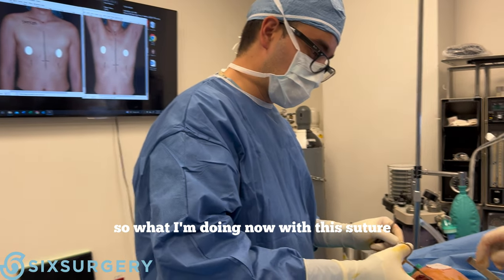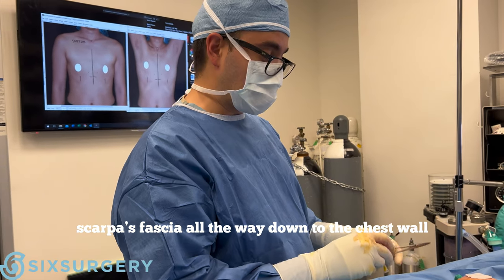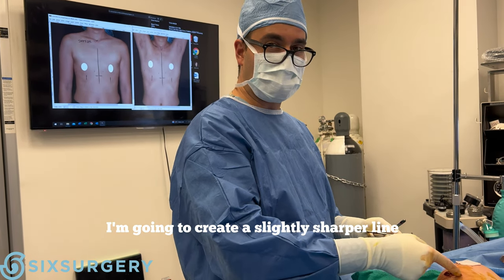What I'm doing now with this suture is actually connecting the fascia above and the fascia below — Scarpa's fascia — all the way down to the chest wall at the inframammary fold. By tightening this, I'm going to create a slightly sharper line.